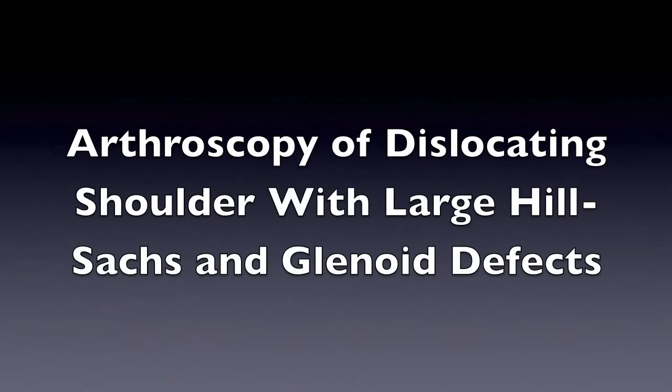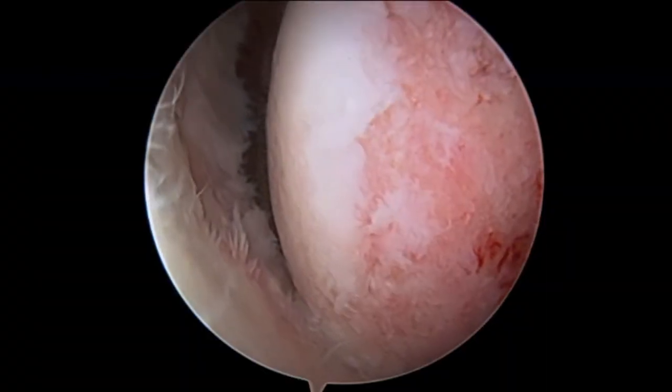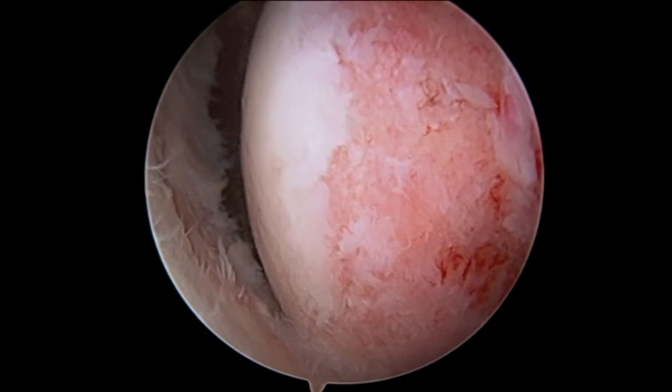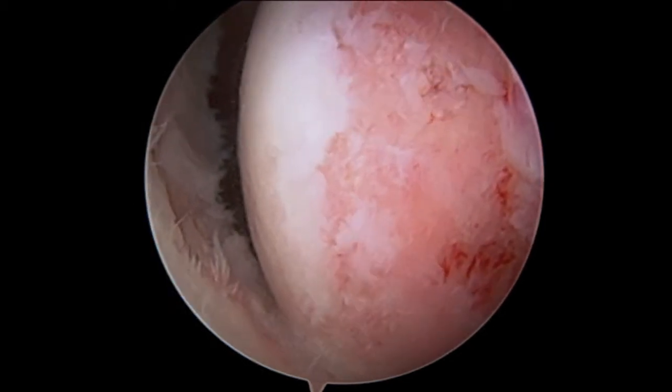This video shows a diagnostic arthroscopy of a right shoulder in a Division I college football player who has sustained multiple dislocations anteriorly in the right shoulder, or to the front. To the right of the screen is the back side of the ball. To the left is the glenoid socket.